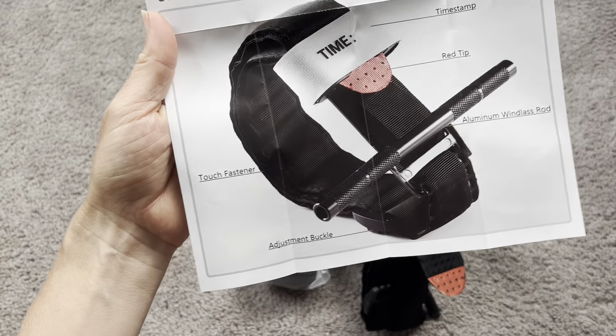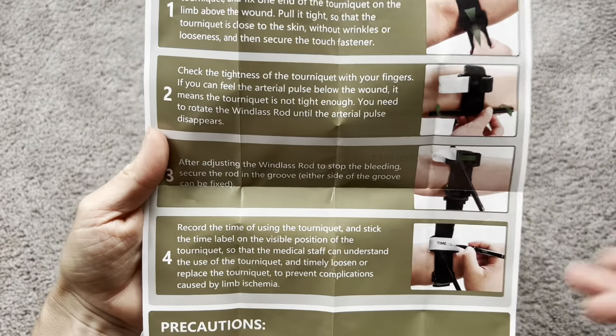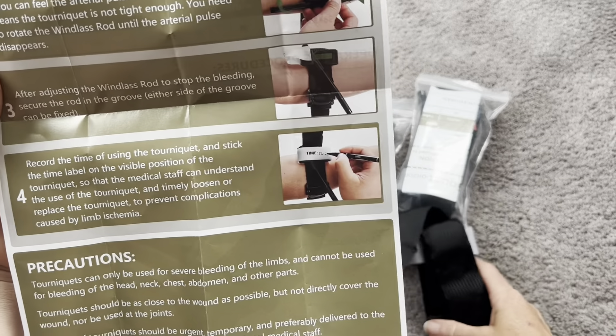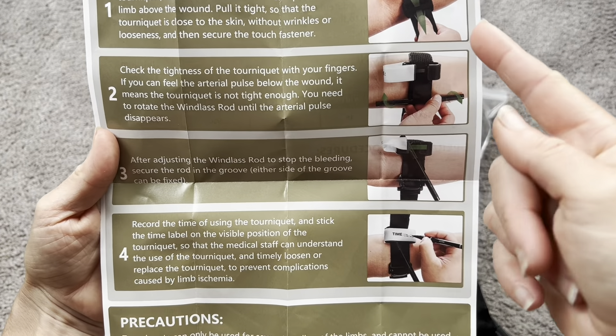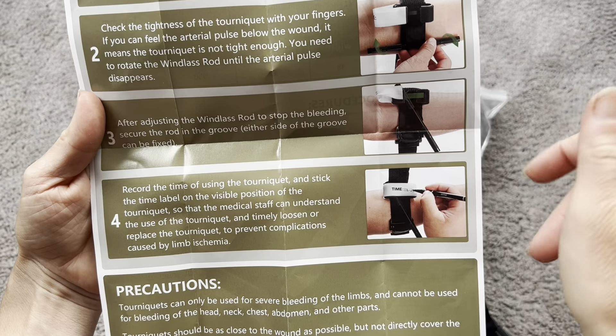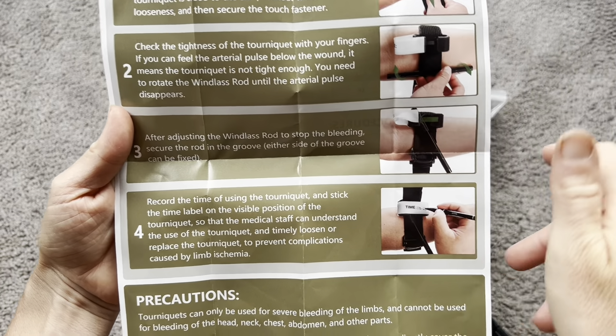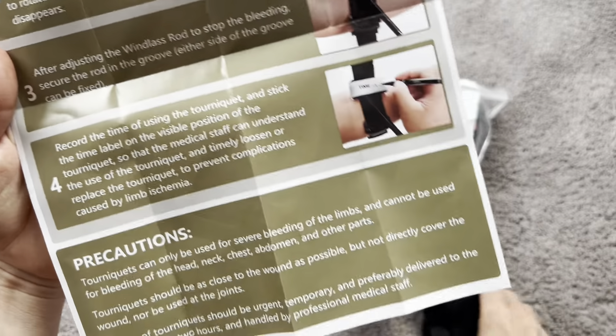They're very simple to use and have a few great features. It does show you exact directions on how to use these, so you want to go over this when you first get them so that you know how to use them in an emergency. All you're going to do is pull it tight and twist this windlass rod, which is going to really tighten the tourniquet and completely stop the bleeding. You turn that until the bleeding stops, and I love that it has a time stamp so you can write down exactly when the tourniquet was applied.